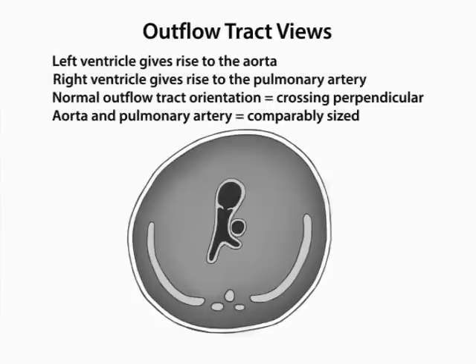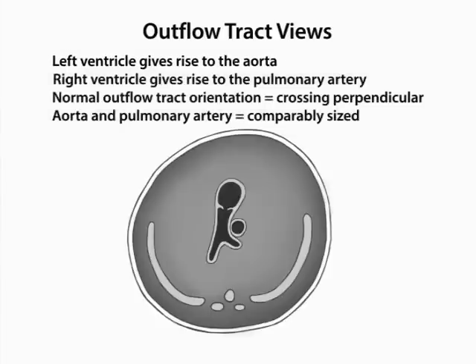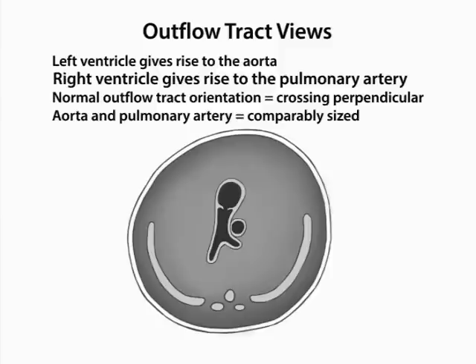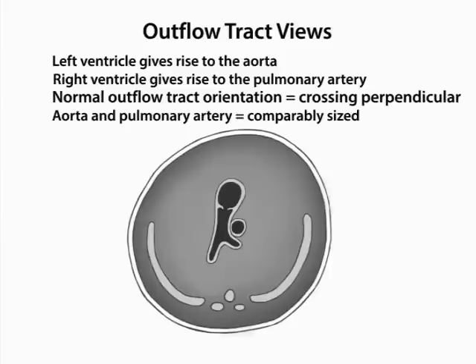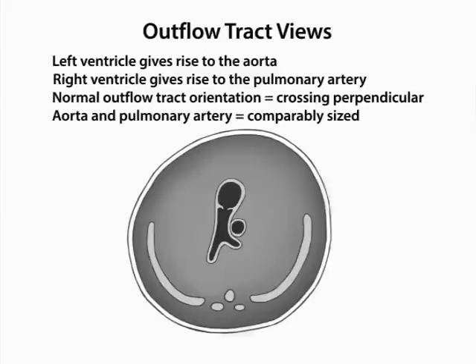Together, outflow track views show the left ventricle giving rise to the aorta, the right ventricle giving rise to the pulmonary artery, show normal orientation — that is, perpendicular crossing of the two outflow tracks — and show comparably sized aorta and pulmonary artery.